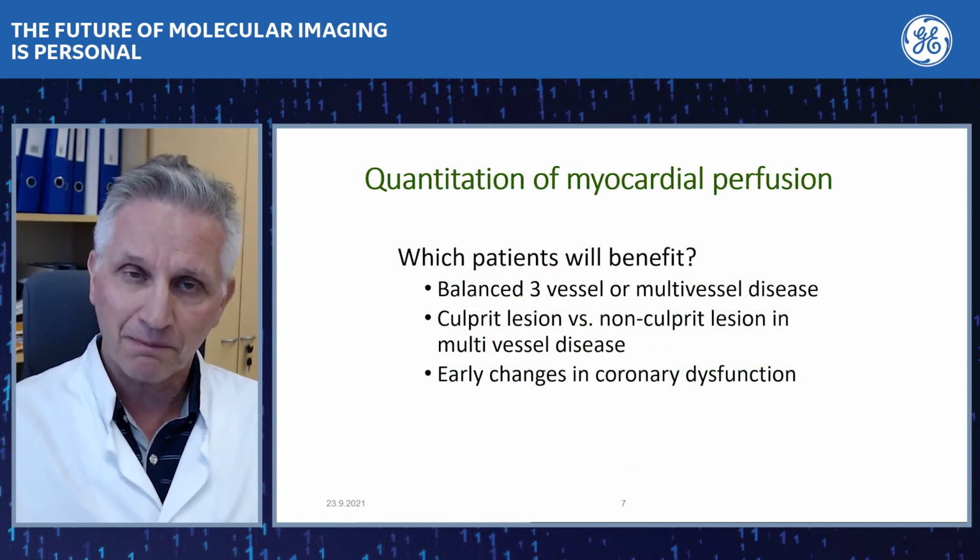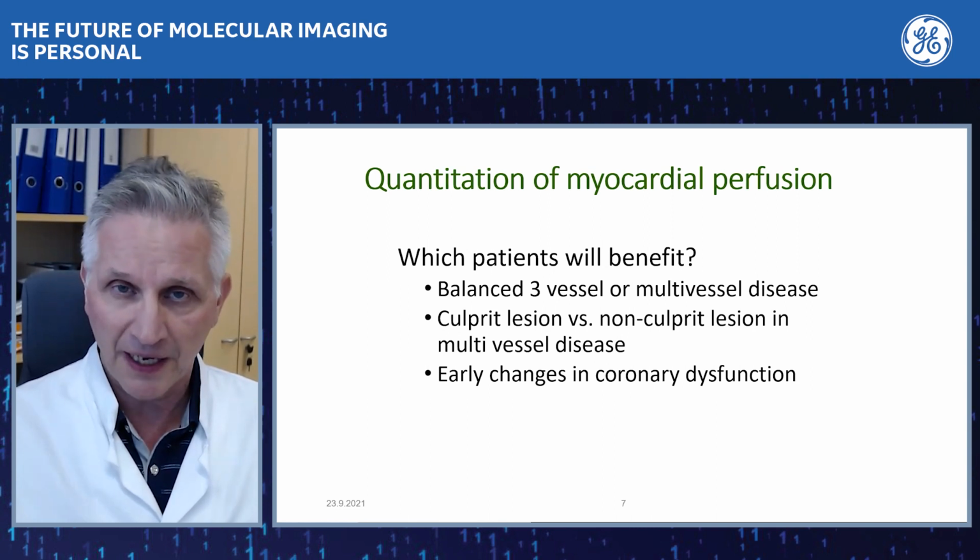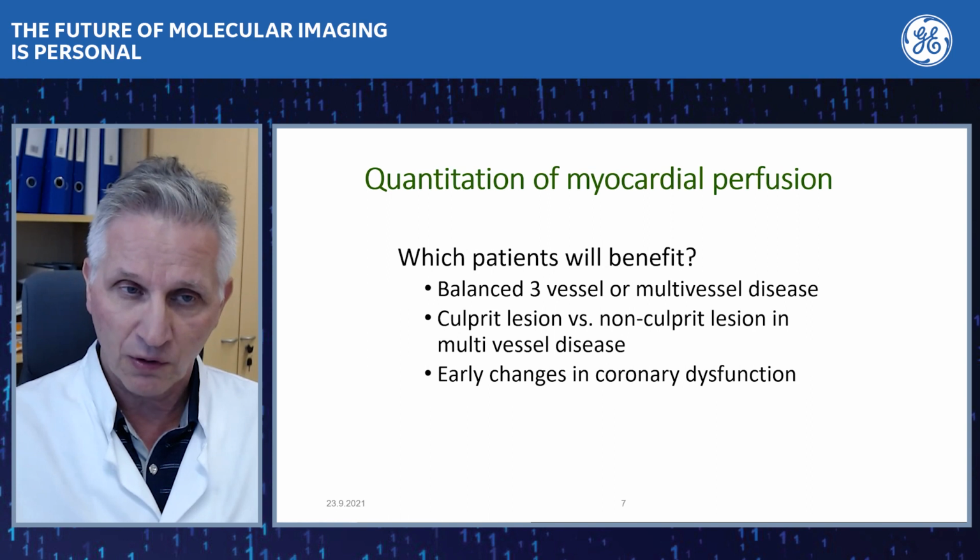So what is the reason why PET is so good? It can be explained by many factors, but one of the factors is the absolute quantification.